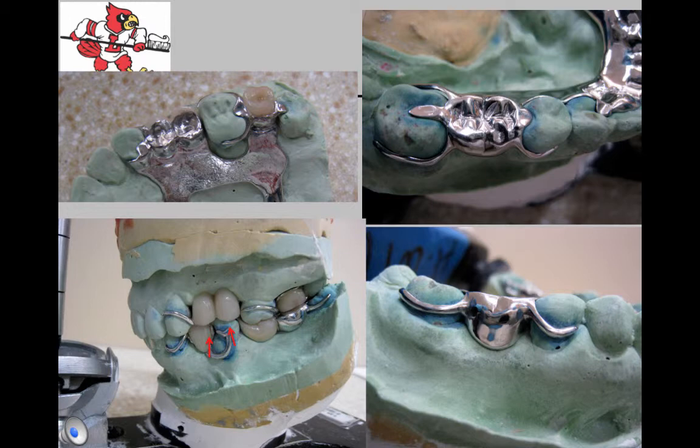The tube tooth, if left long, would have a very long, thin buccal cusp that would be unsupported and break more easily than the facing. So I wanted the teeth to be as long as the teeth in front and back of the edentulous space and be protected from breaking by the metal surface supporting the buccal cusp. They didn't send it back that way.